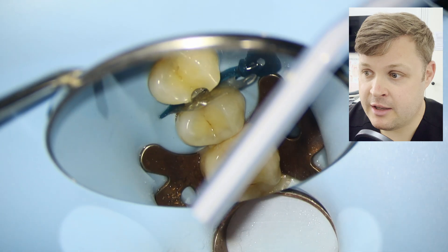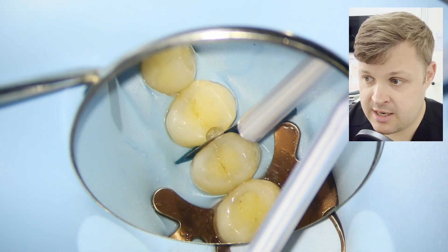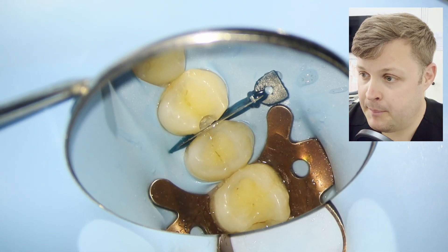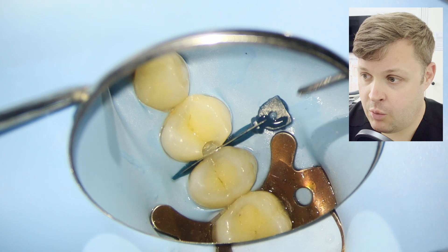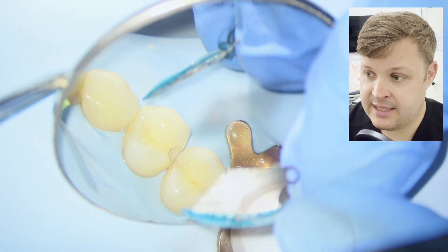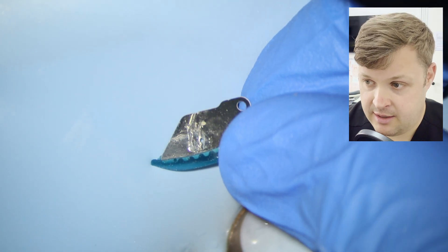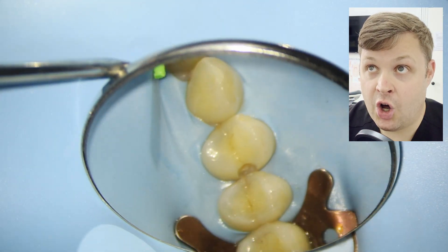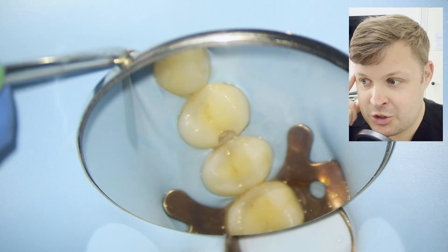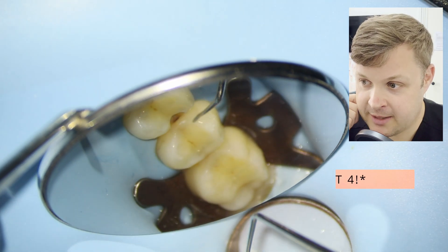As you can see, we've drilled out the decay completely. As we pull the wedge guard away and inspect the silver protective part, you can see that the grinding would have been on the tooth itself. But when we looked at the tooth, I can see there's decay in the distal aspect of that tooth as well.